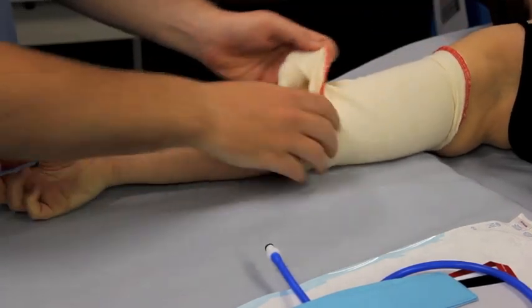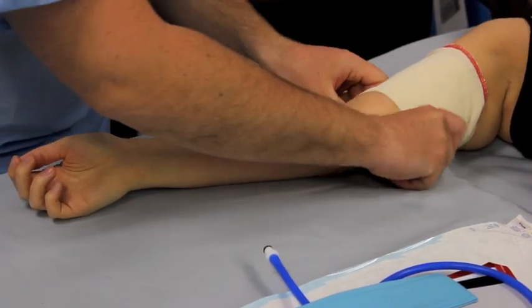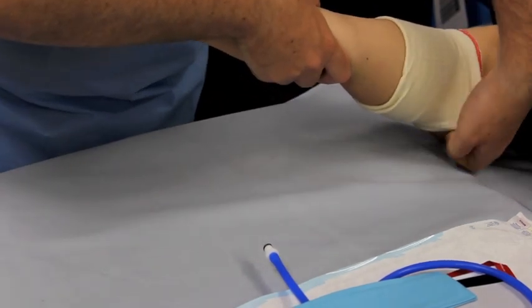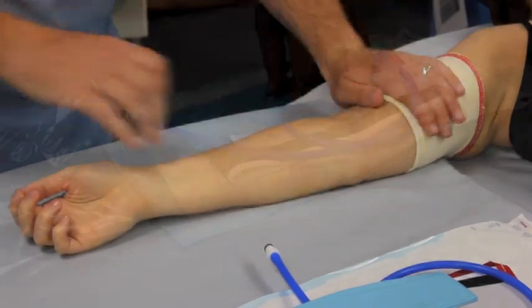Too thick a layer should be avoided as it will increase the required pressure for safe limb occlusion. For this reason, it is recommended that two layers of padding should be used. The VBM padding is patient specific which facilitates easy placement without wrinkling.